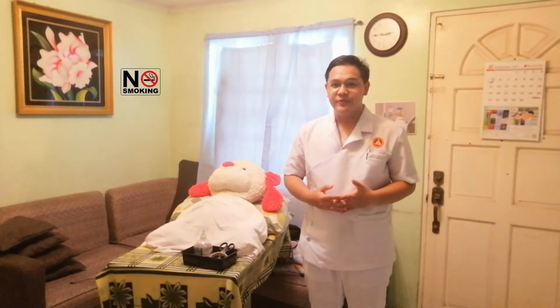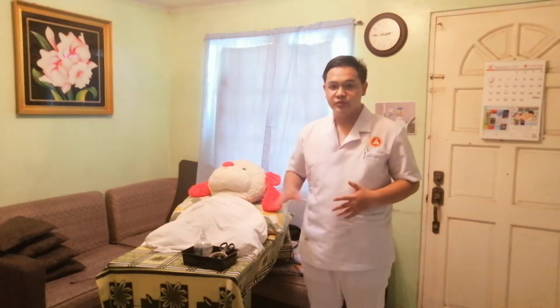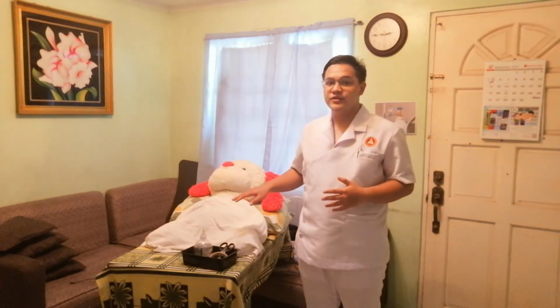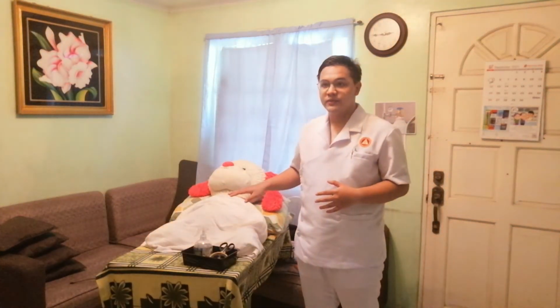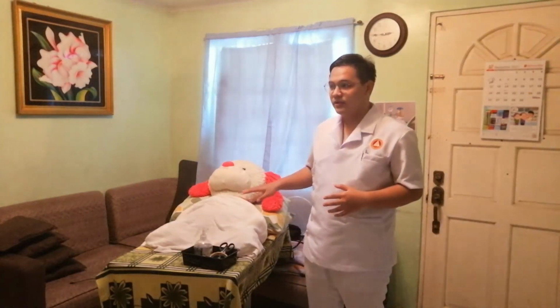So for our next step, we need to assess our client regularly. To do that, we will be assessing the client's nares. We will be checking if there are any presence of encrustations and irritations, and we need to apply a water-soluble lubricant as required to suit the mucous membrane. Okay?